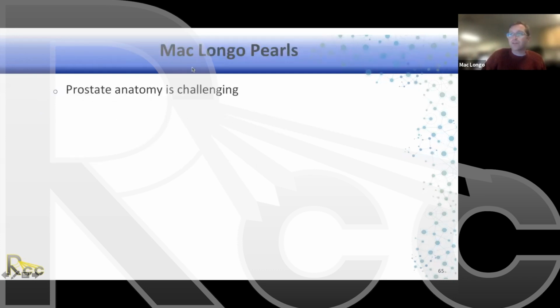So we're drawing to a close of our evening, and I just want to share some of the lessons that I've learned over time. Prostate anatomy, for such a small organ, gosh, can be difficult at times, and there's variation from patient to patient. Even in the limited number of patients that I shared with you, all patients that I've treated within the past couple of weeks, there's a lot of variability in the way their prostates appear and subsequently in the way I contour these patients.